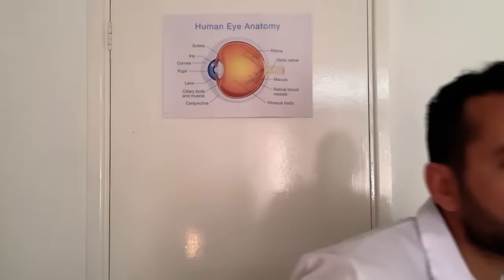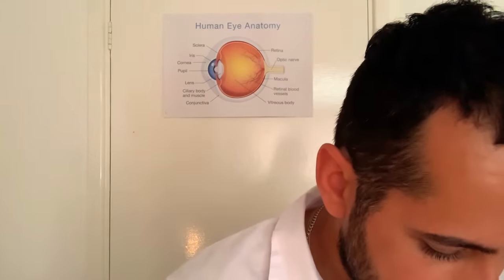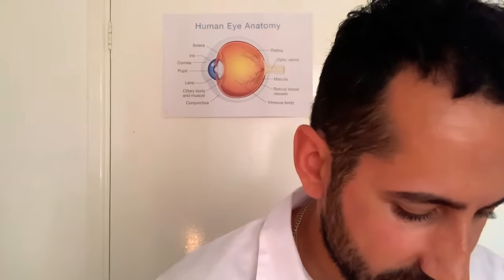Okay. Just checking the pupils. And I'm just going to check the pupil size there. Bright conditions, 4 millimetres. Let's just dim the room lights now. Okay, pupil sizes. In theory, they should dilate when the lights go down. About approximately 6 millimetres in dim conditions.